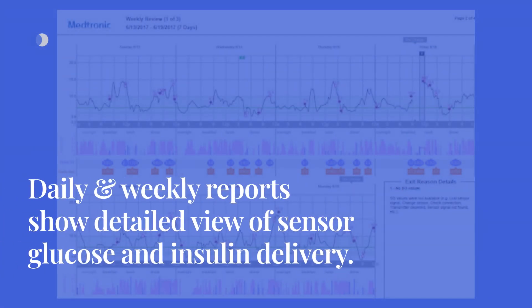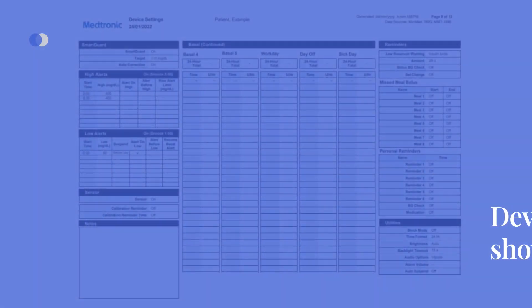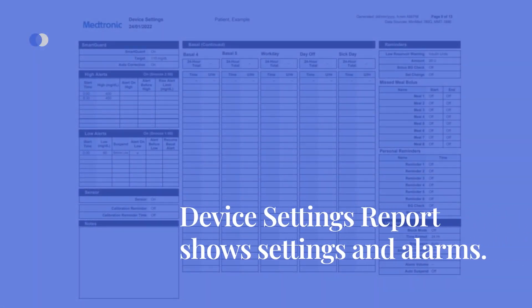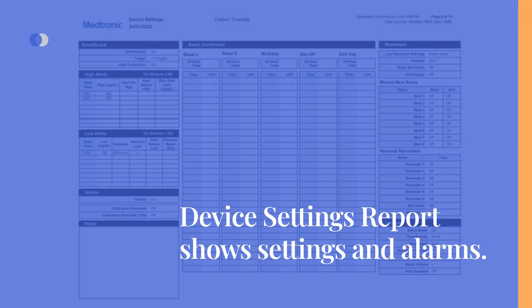Daily and weekly reports offer a detailed view of the relationship between glucose levels and meal correction boluses for each day. Device settings reports show the settings and alarms of the glucose sensor, insulin pump, and AID algorithm.